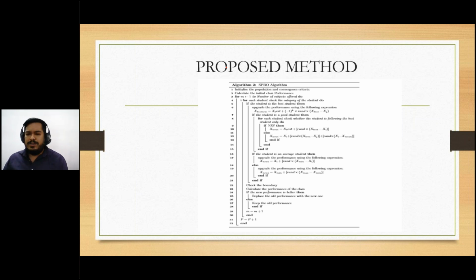To optimize those three parameters in breast MRI registration is going to be a very challenging task for the success of the experiment. So the SPBO algorithm, the student psychology based optimization algorithm, and the multiverse optimization algorithm are going to optimize those three parameters, the parameters for translation and rotation.